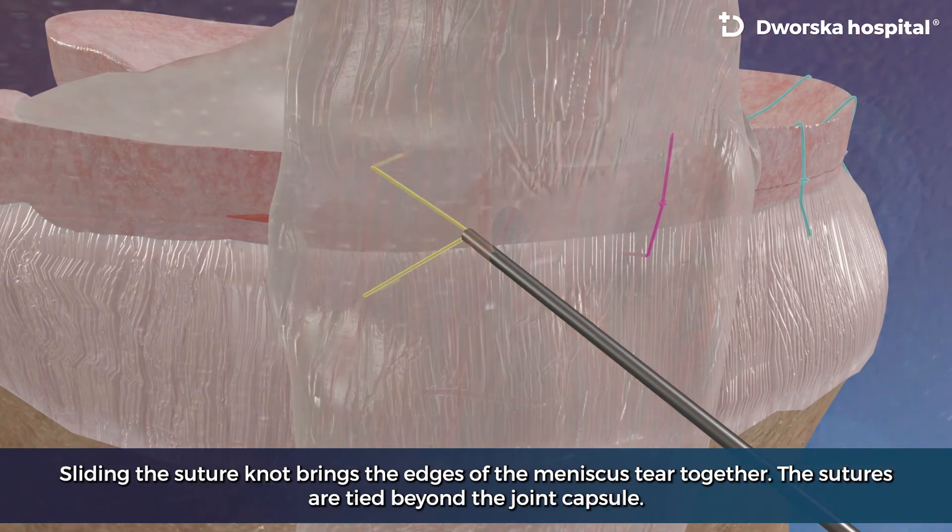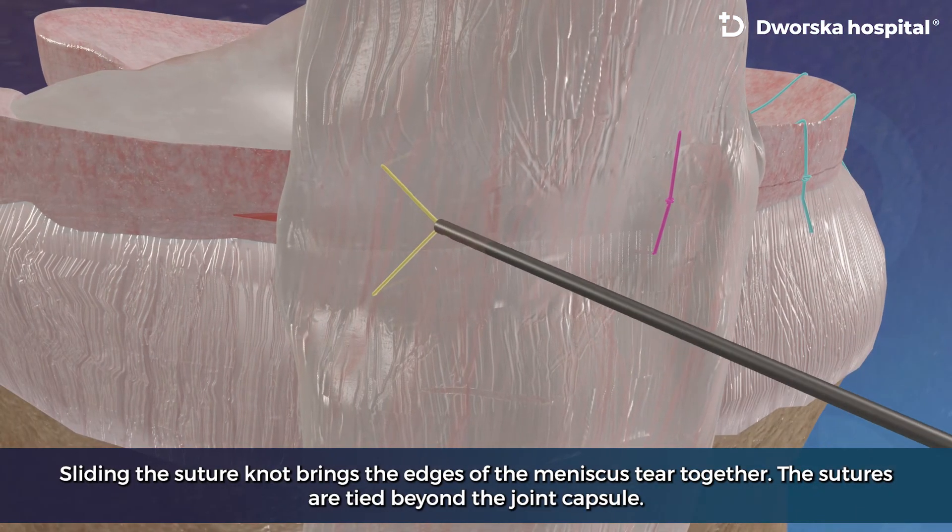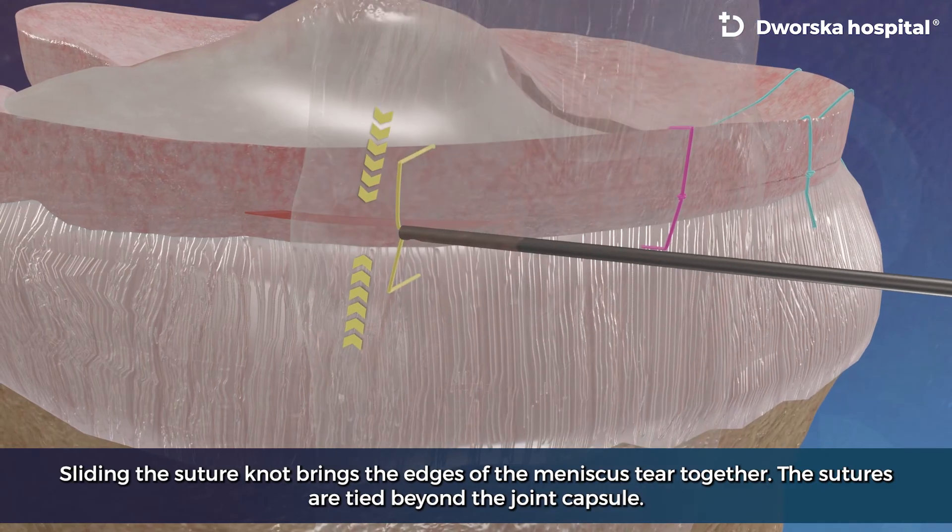Sliding the suture knot brings the edges of the meniscus tear together. The sutures are tightened beyond the joint capsule.